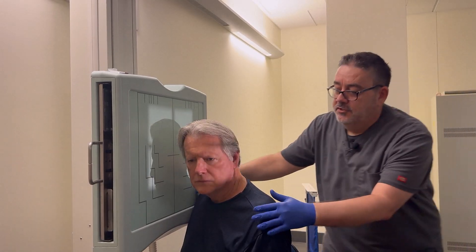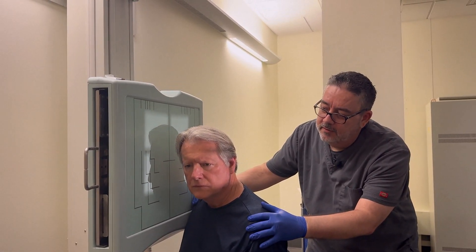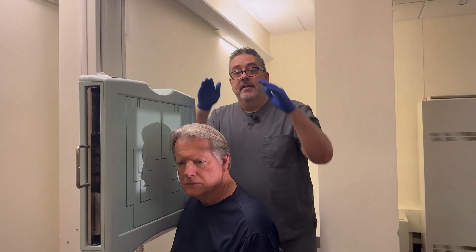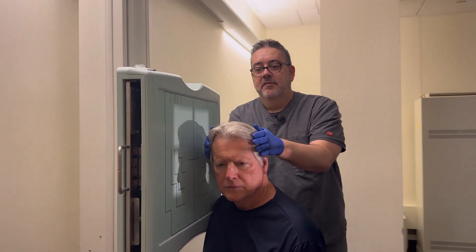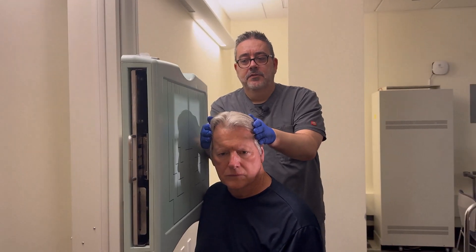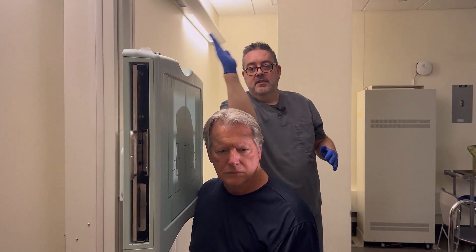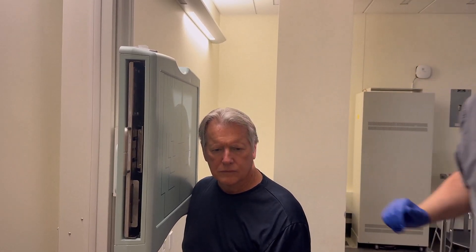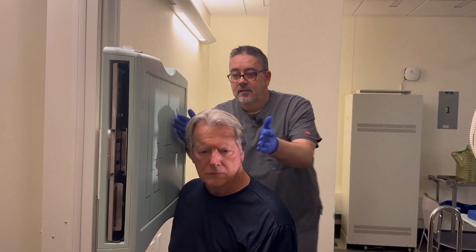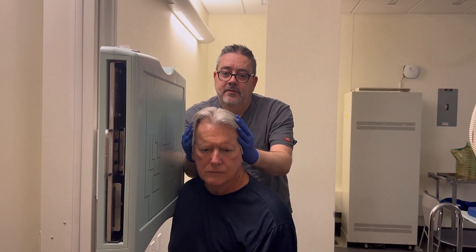I'm going to slide you back just a little bit — right there. I'm getting up at the top looking for rotation left to right, and I'm going to fix that just a little bit. I'm also looking for tilt where the top of the head goes to the right or to the left — just like we've got a little bit. I'm going to turn your head just tilted a little to the left, right there.